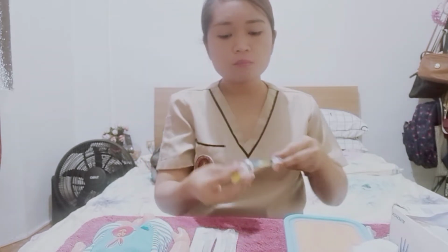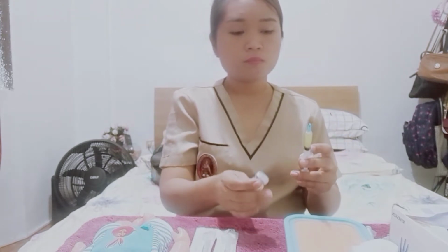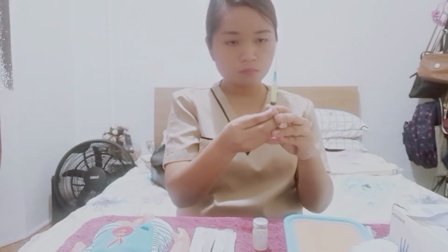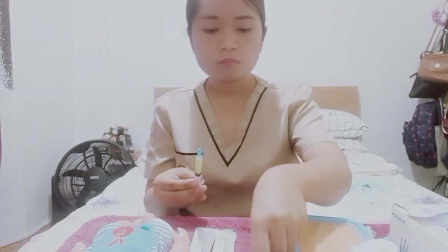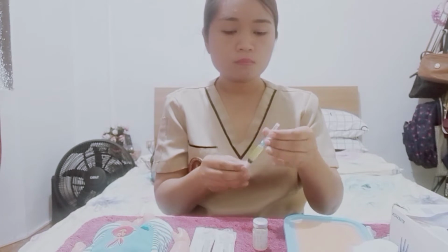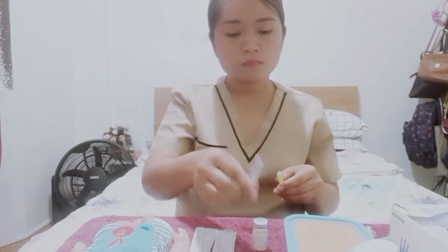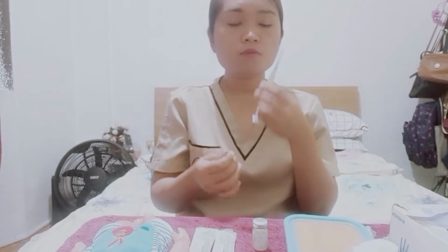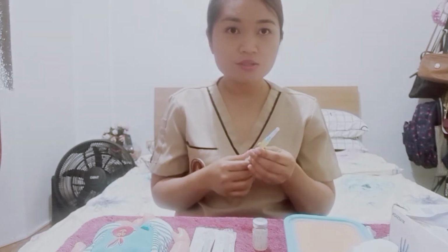So after getting the medication, we then change the needle before administering it to the patient.